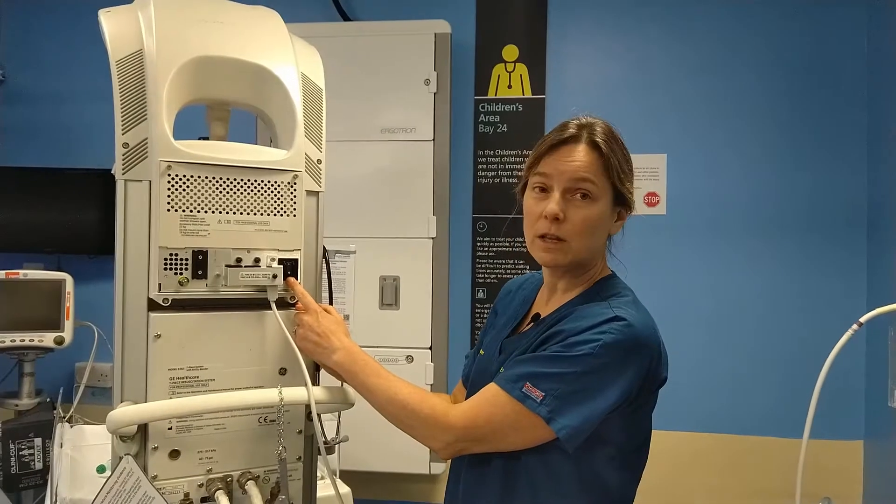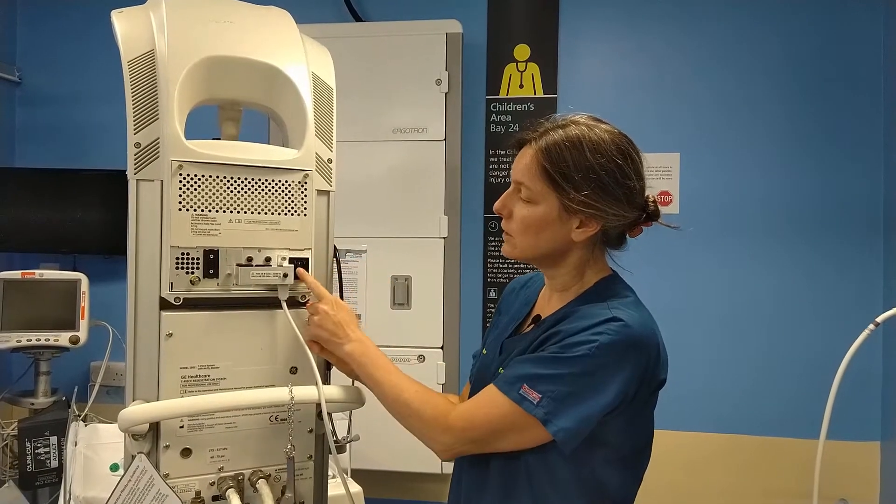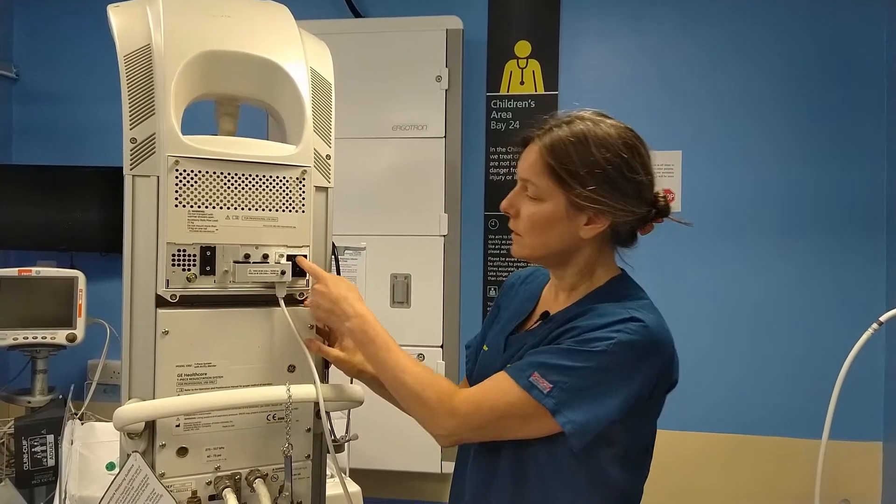Be aware there is an on-off switch at the back. It's usually left in the on position, but if you find that it's off you must switch it on.